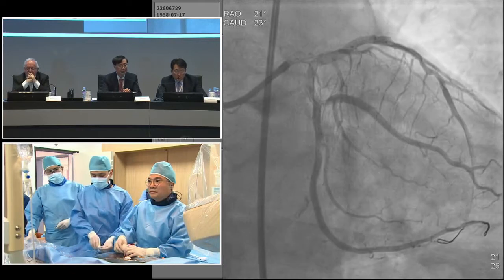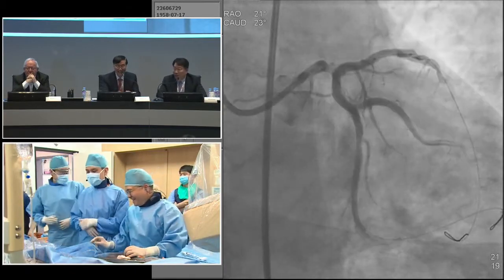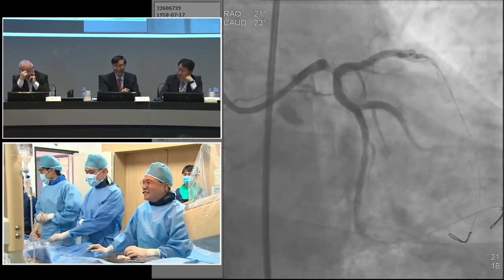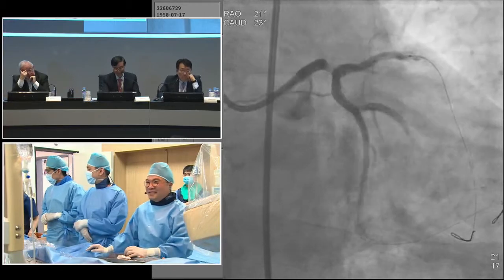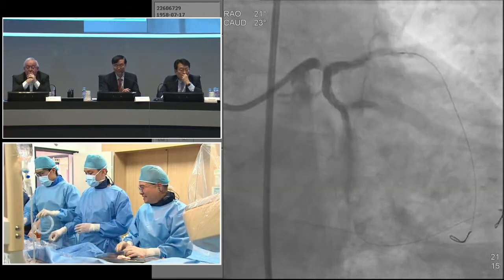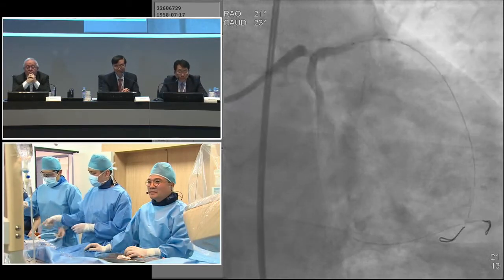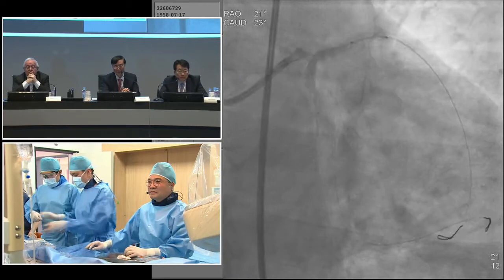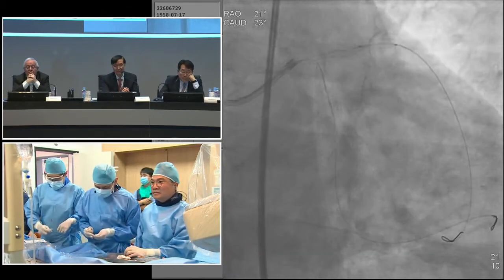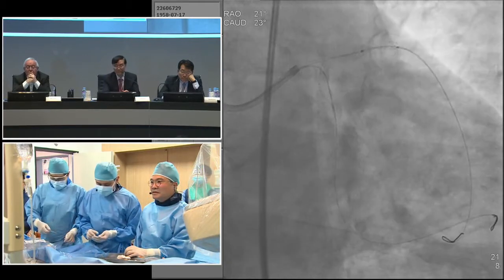Totally depending on Dr. Hong. Yes. Gwangju, right? It's both. I think right now the suggestion from the IVUS information is very good. Marginal branch flow is getting better, and you chose just a T stent or a small crush, mini crush? Yes.